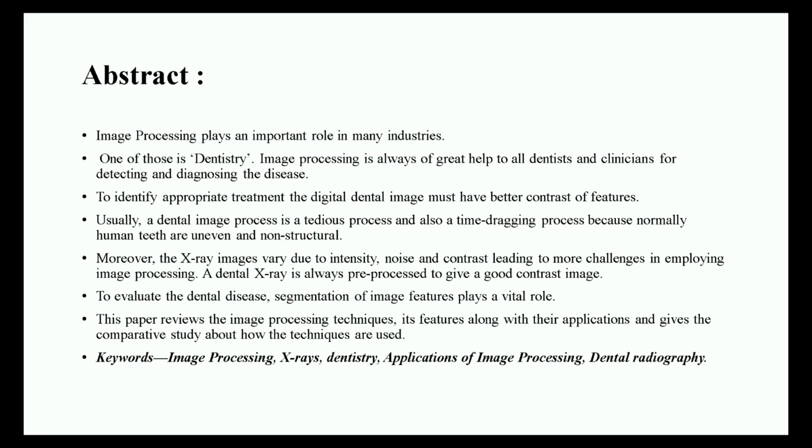Image processing is always a great help to dentists and clinicians for detecting and diagnosing any disease. To identify the appropriate treatment, the dental image must have better contrast of all features. Usually, dental image processing is a tedious and time-dragging process because human teeth are not even and are non-structured. Moreover, X-ray images vary due to noise, intensity, and contrast, leading to more challenges in employing image processing. A dental X-ray is always pre-processed to give a good contrast image.